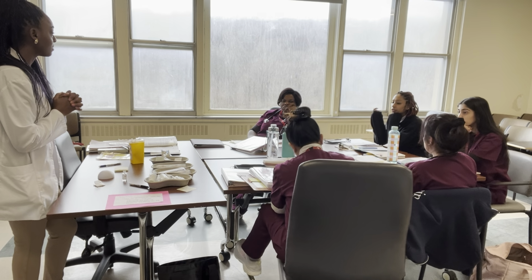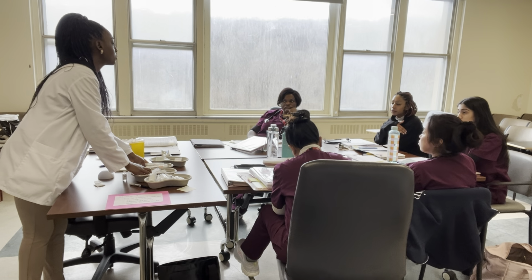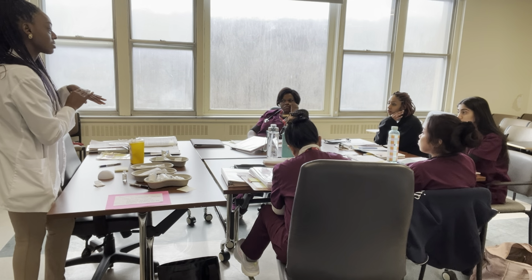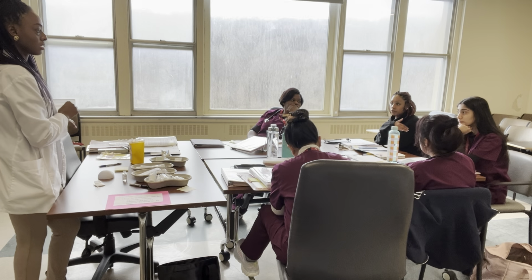Okay. With insulin, after you inject, I know you're supposed to rub it, but some people rub. We don't rub. No. We just hold it down. You're not supposed to rub. I've seen some people rub instead of just wiping. So you're just putting pressure onto the site to stop the bleeding if there's bleeding. No, I know, but I remember in school they said it's a reason why you don't rub, but I've seen people rub after they inject.